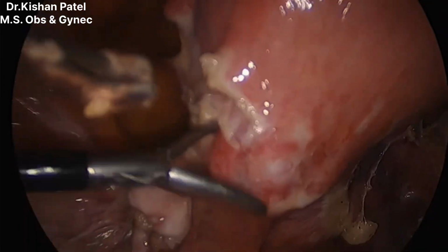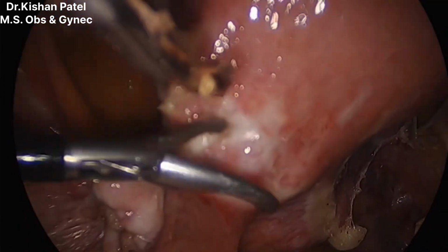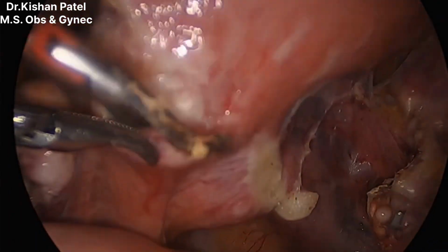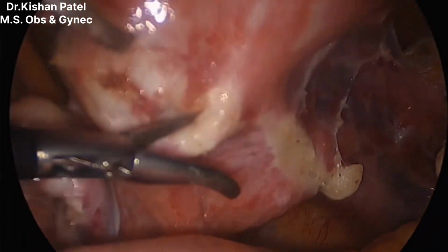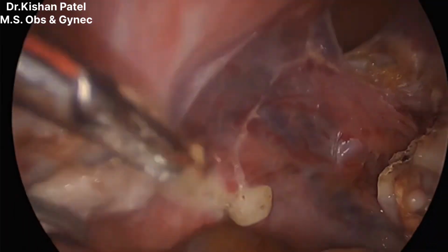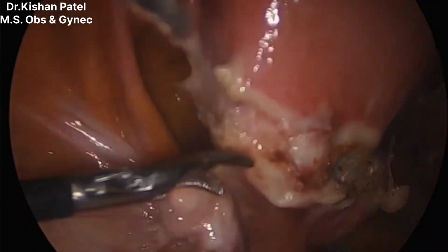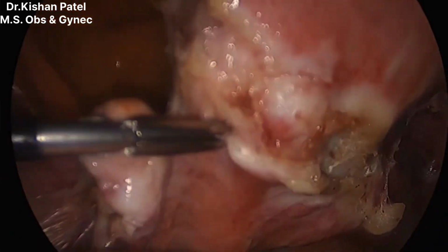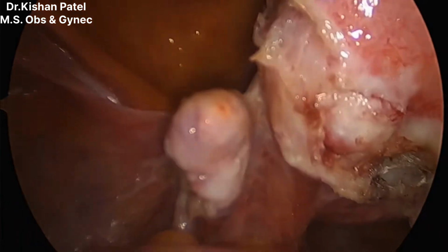the peritoneum from the fibroid, then we'll separate from the fibroid, okay. So I am cutting the peritoneum only and reaching downward. Now I will separate the peritoneum from the fibroid, so we can reach up to the uterosacral ligament.